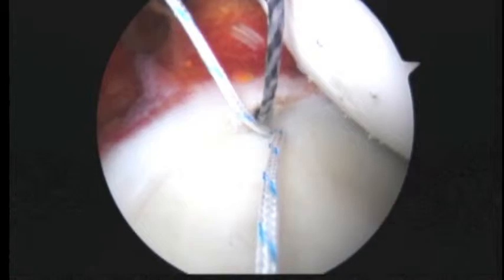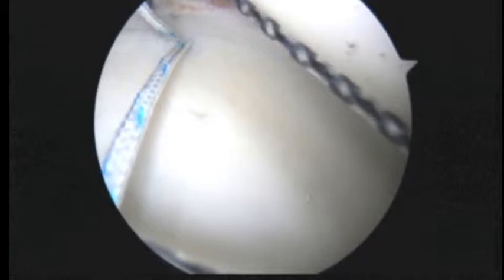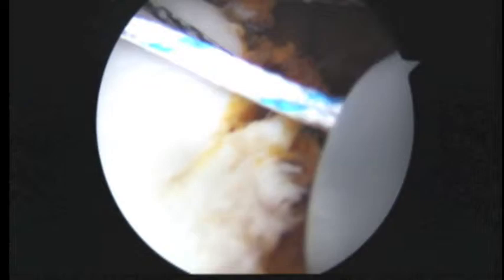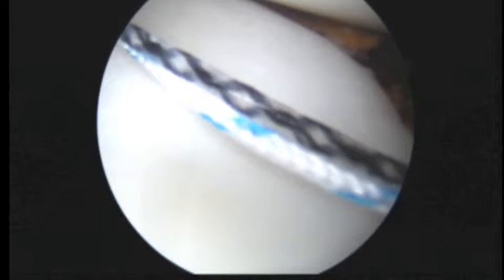Now the next step is just to retrieve the super shuttle. We'll reach in and get it right over here. Outside your shoulder, we will load that.